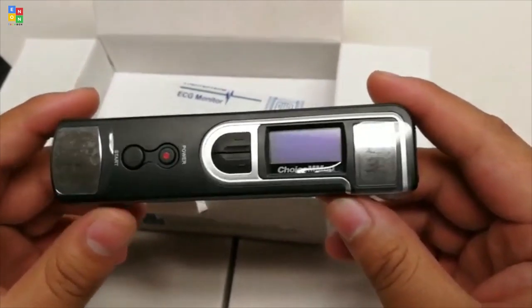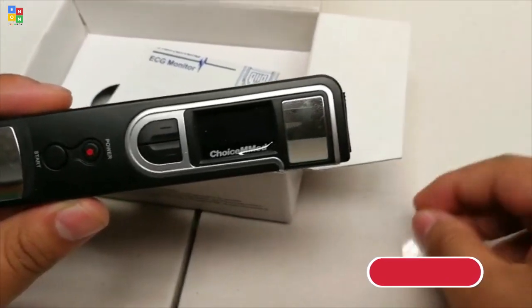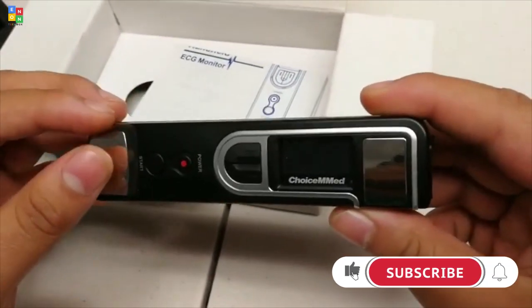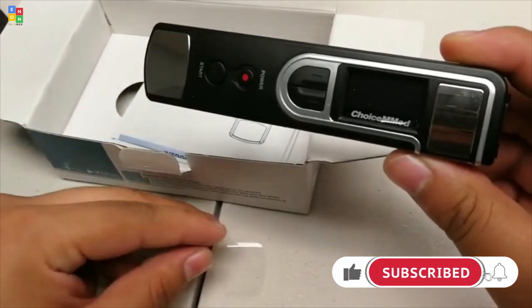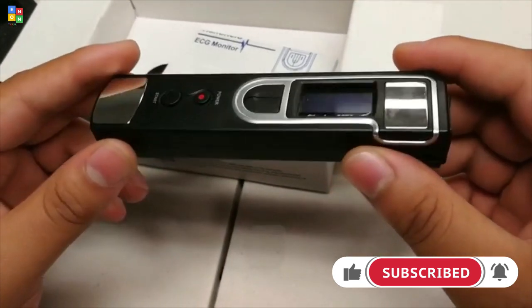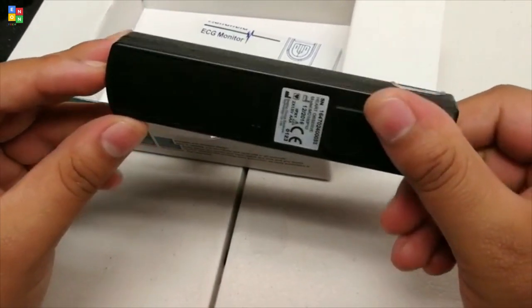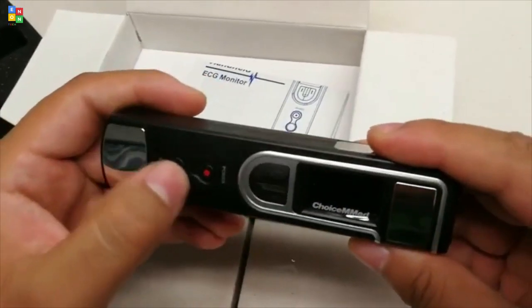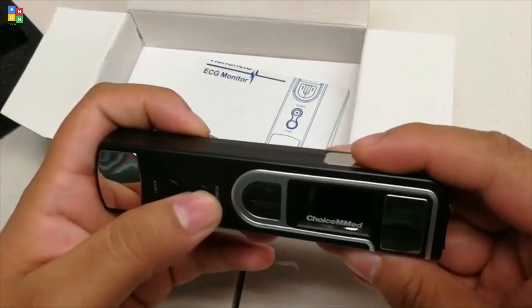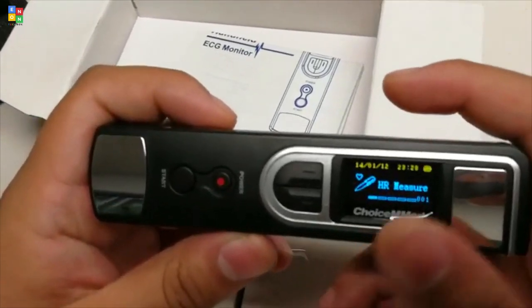To begin with, please remember to remove the plastic covering the metal leads. This is very important, as if you do not remove the plastic, it will not give you an accurate reading. Also included with this device will be batteries. For this tutorial, we have pre-installed them. To get started, please hold on to the power button, at which point the unit will power on.